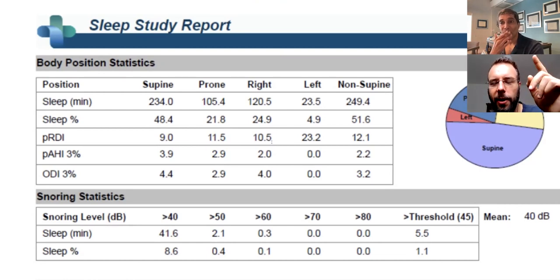And let's note too that we can measure this now, right? We can objectively measure nasal resistance and nasal flow. So you can confirm this. We don't have to play a guessing game and go get 10 nasal surgeries. We can find out for sure, right? Yes, you can do rhinomanometry and you can have that checked. You can do a cone beam CT and just look and see what's happening.